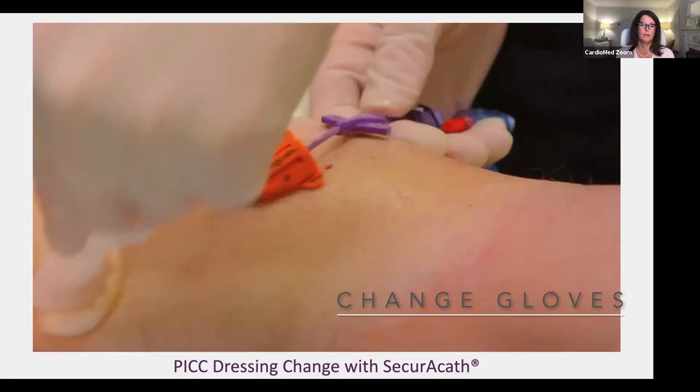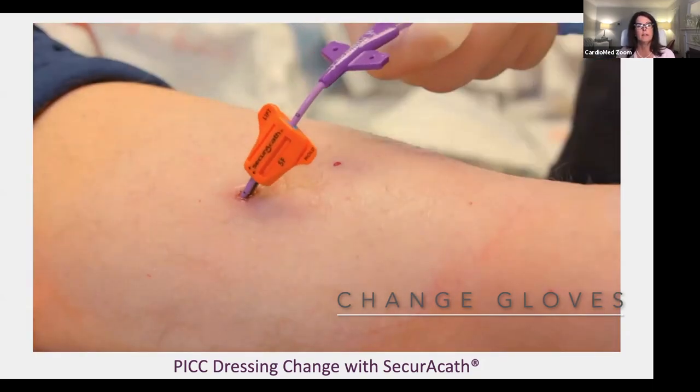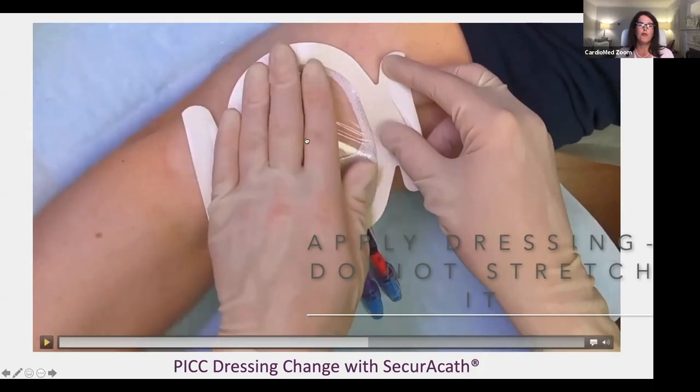Change your gloves before applying the new dressing. So you let the skin dry. Dress the catheter site per your institute's protocol. Make sure that you don't stretch that dressing though. This dressing looks like it was being stretched perhaps a little bit. If you stretch that dressing, you can cause skin injury.